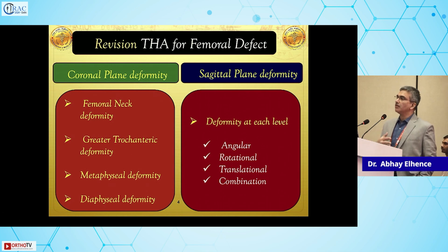When you see the same pathology from the side, you want to see whether it is angular, whether it is rotational, whether it is translational, or invariably a combination of all these. And those subtle changes, if we do not recognize preoperatively and plan for, we will run into intraoperative problems and complications.